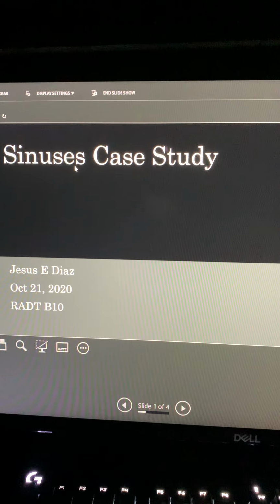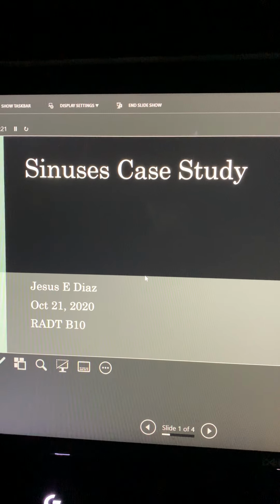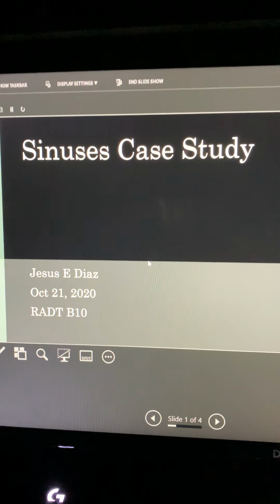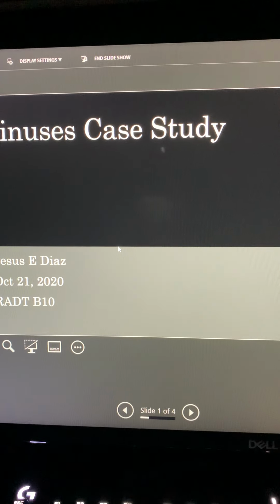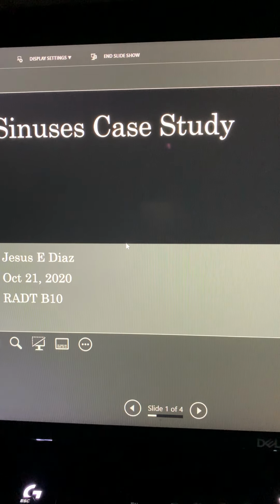Hello, my name is Eddie, and today I will be presenting a case study on a routine sinus case at Kern Radiology. Our patient is a 36-year-old female with a chief complaint of headaches and pain to the right side.